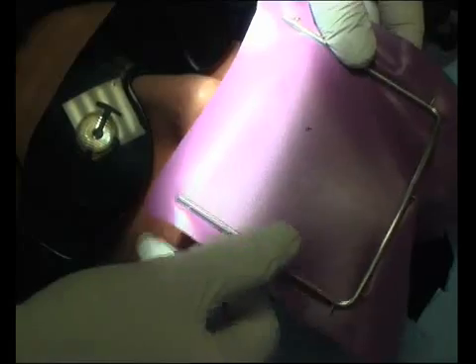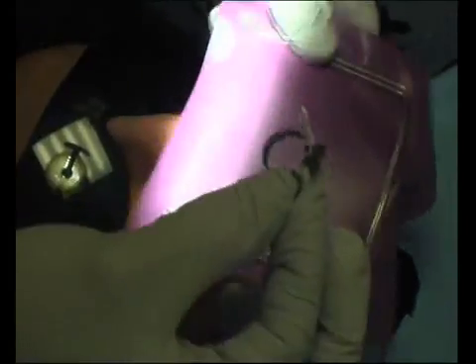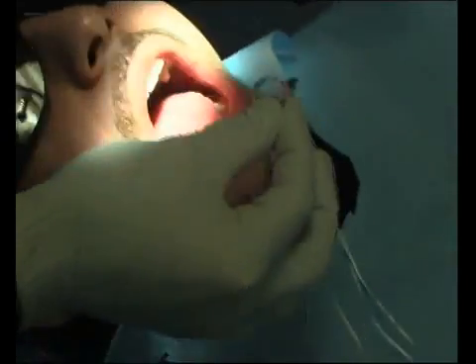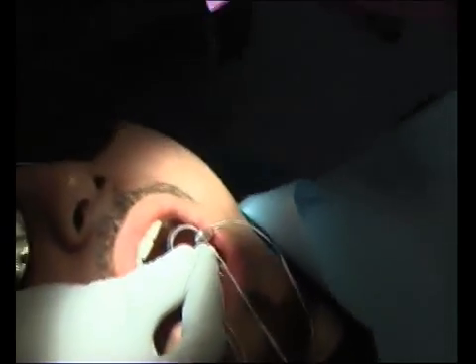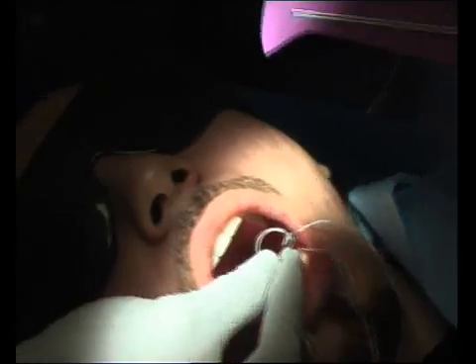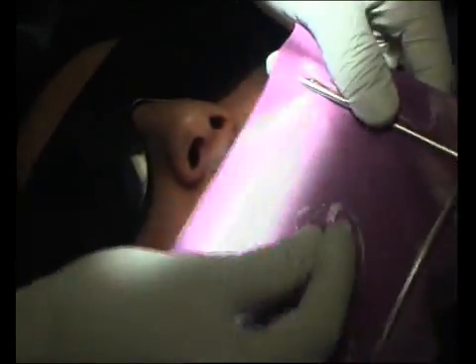So if we demonstrate now on the patient — the bar is sitting underneath the patient's chin. So if I just go around here. We take the rubber dam clamp, you just open it — the rubber dam clamp is going to be facing forward. So we're going to place this now facing forward.